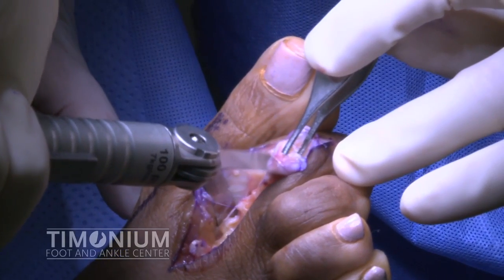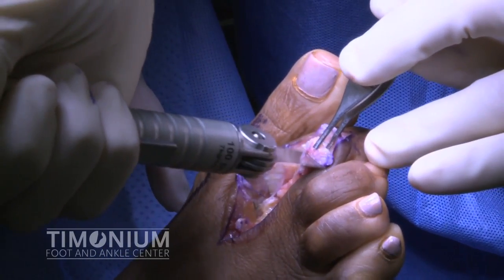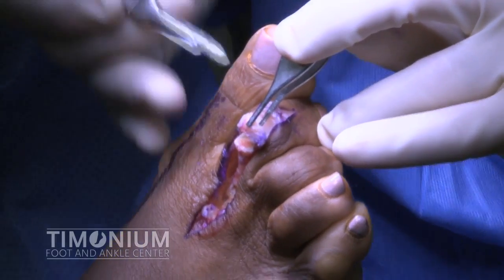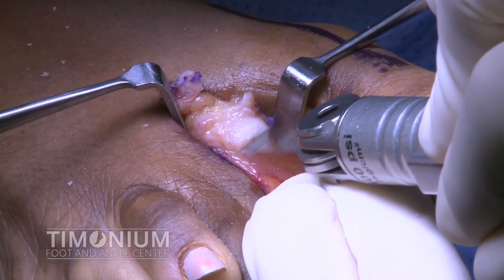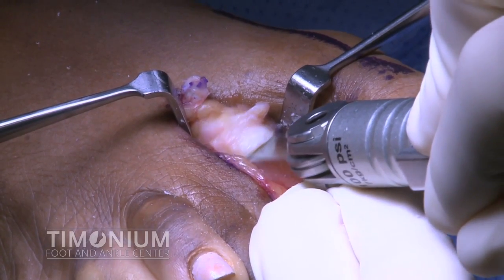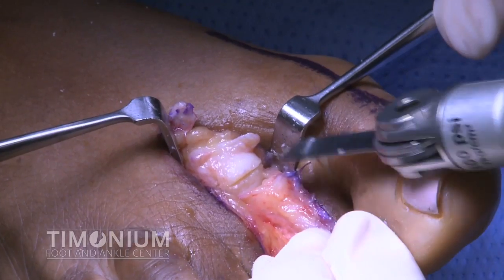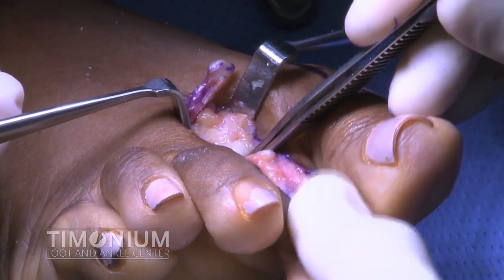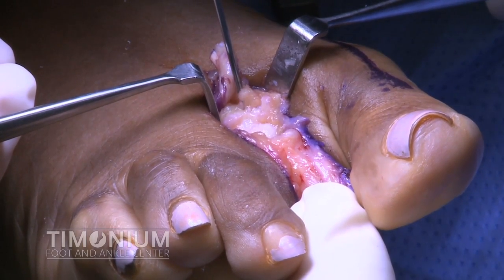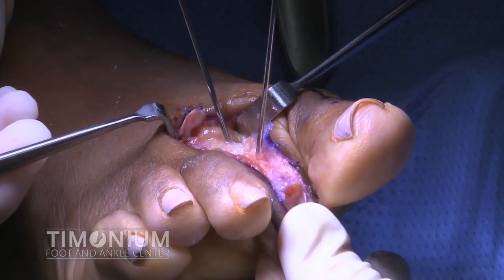Next, a McGlamry elevator is introduced into the second metatarsophalangeal joint and is used to free the plantar plate. The head of the second digit proximal phalanx is transected with a sagittal saw and removed. Next, a Weil osteotomy is performed in the head of the second metatarsal. The capital fragment is then migrated proximally, and a K-wire is used to temporarily fixate the bone.